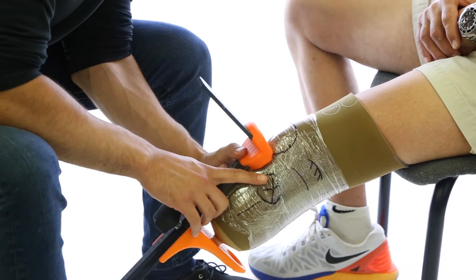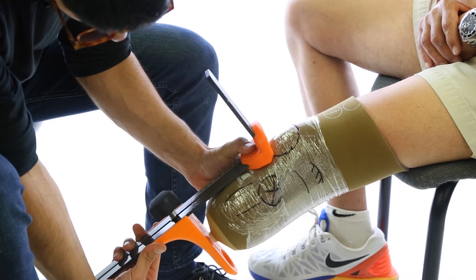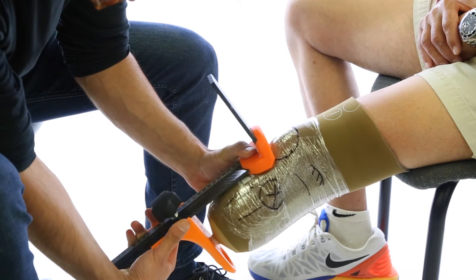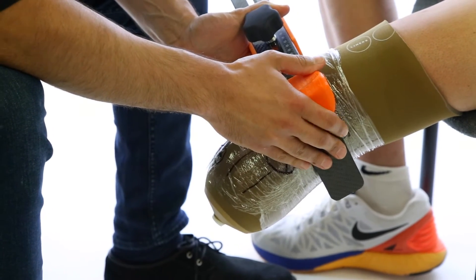With the patient relaxed, we place the tape measure on the mid-patellar tendon and record the end at the distal end of the limb with slight compression. This should give us the length of the limb that we need. Then we need the ML dimension at mid-patella.